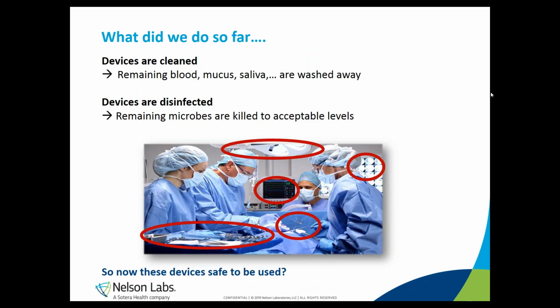After the disinfection validation, we have not only washed away any debris like blood, but now also microbes are killed to an acceptable level. So for those devices that only need the cleaning and disinfection step and no further sterilization step, these are now ready to be used for the next patient. They are considered to be safe. Is that correct? No, actually not.